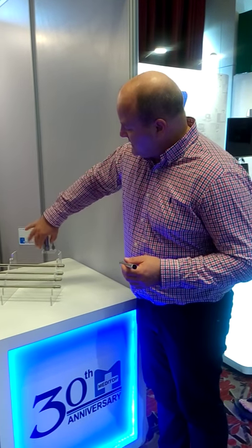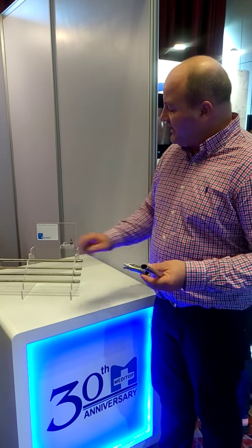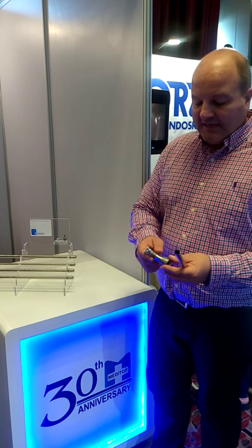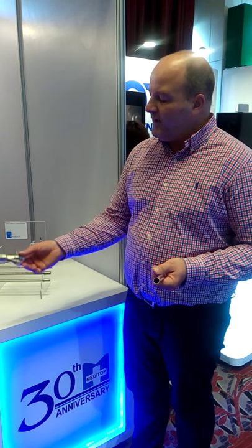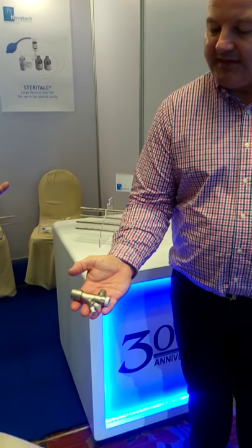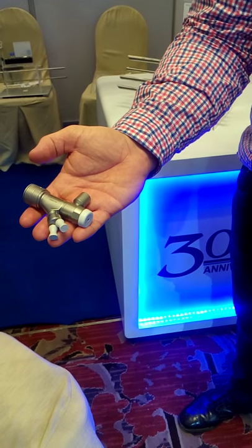What's new about this bronchoscope is that before, you had for each and every size one complete set that could not be detached. With the new Dutaux Novatec Bronchoscope, you have one basic unit, as you can see here, and it connects to all different tubes.